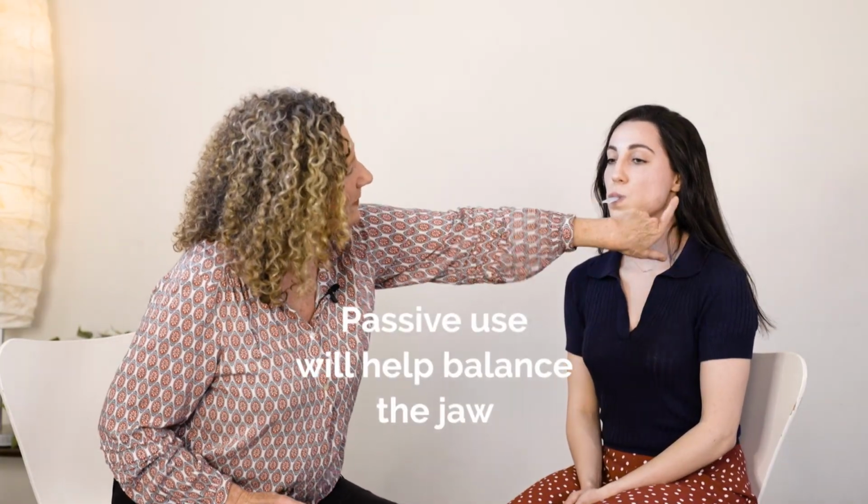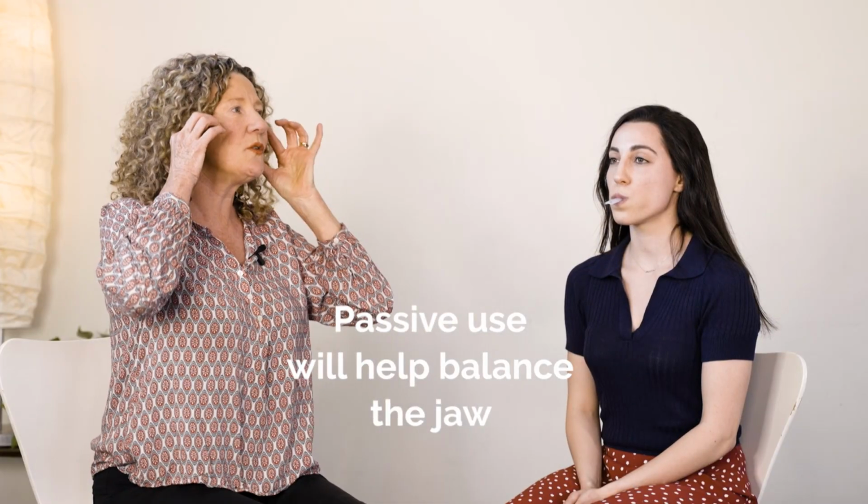So do you want to just pop that in and we can talk about what that looks like and why you use it passively. So when you've got it in and you're not chewing, what that's doing is it's helping the temporomandibular joint, which is the joint at the side of the jaw. It's helping this joint to become more balanced because the munchie's putting the jaws into a more balanced posture.